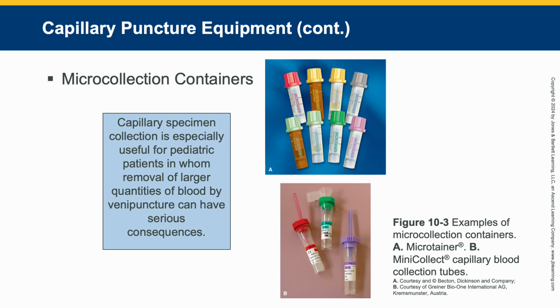If you get just a little bit in that syringe, now I'm not talking about if you use the evacuated tube system, like if you're putting the tube on there, you can't take what's in the tube and pour it into this. But I'm saying if you draw it from a syringe, if it's a difficult draw and it's in a syringe, sometimes you can take what's in that syringe and put it in this microtube. But it must not, and pay attention to that, it must not be done unless the microtube manufacturer supports that.